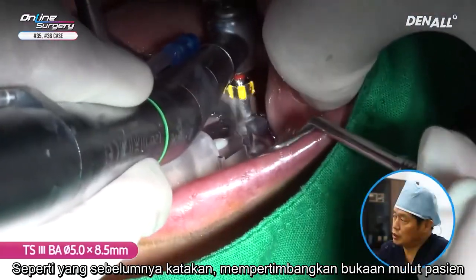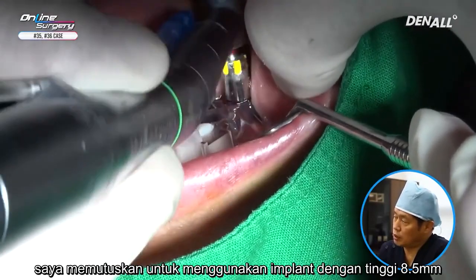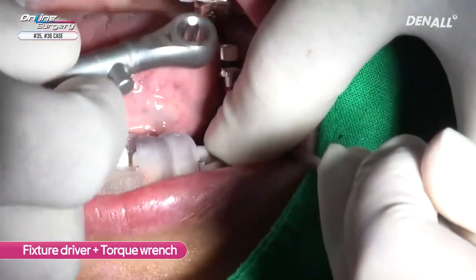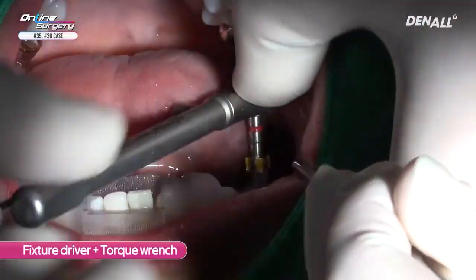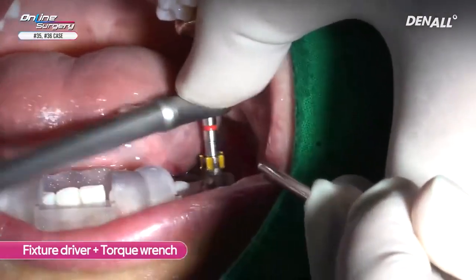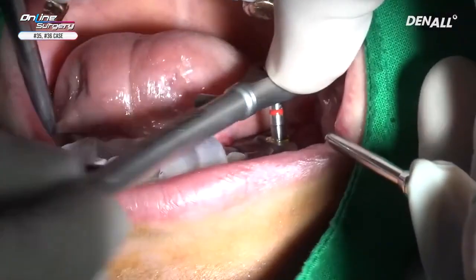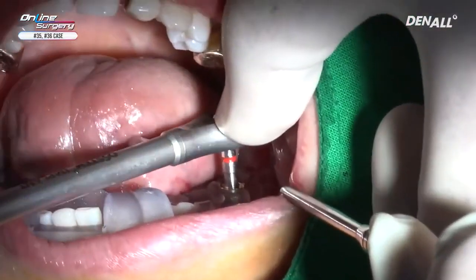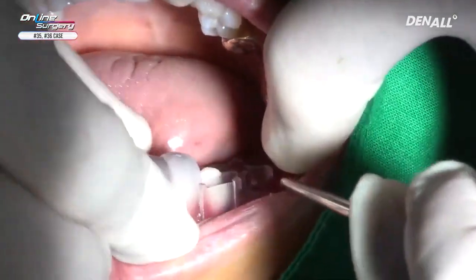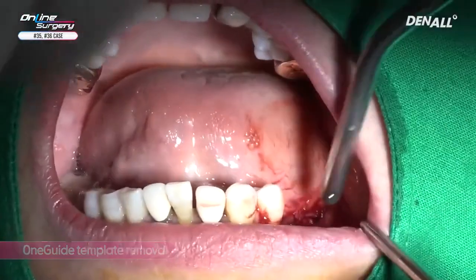As mentioned earlier, considering the patient's level of mouth opening, I decided to place an 8.5 implant. Wider. Now implants have been placed.